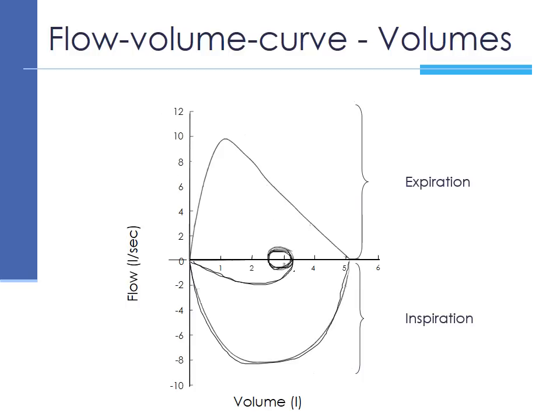because remember, as normal breaths were taking place during the small circle over here, then there was inspiration. This was followed by the forceful and quick expiration until the beep. So anything that happens above the x-axis represents expiration.